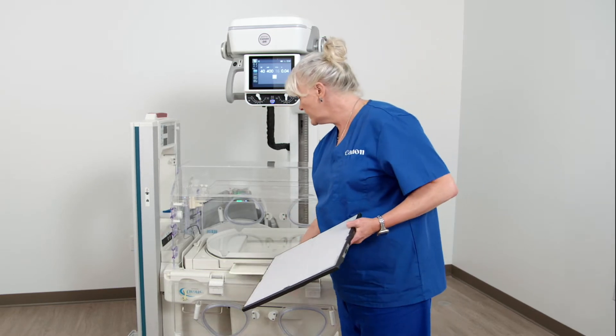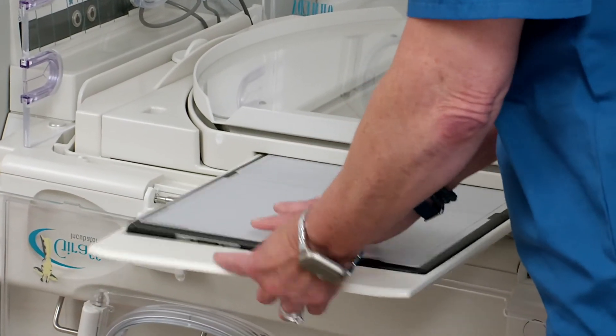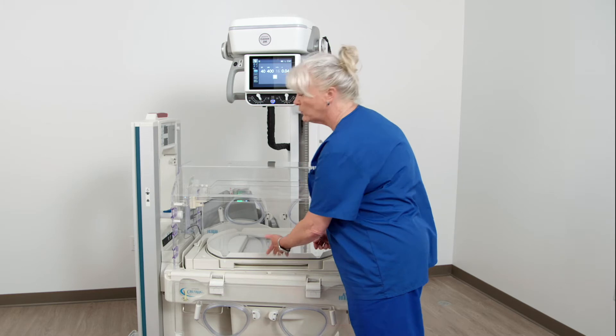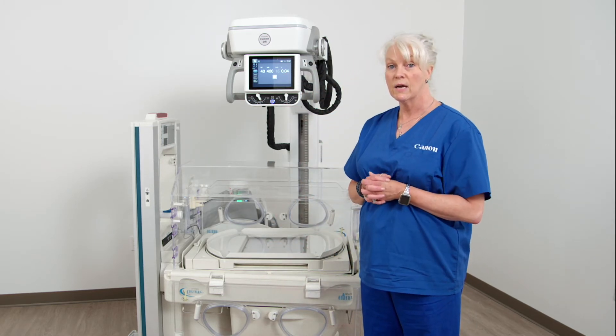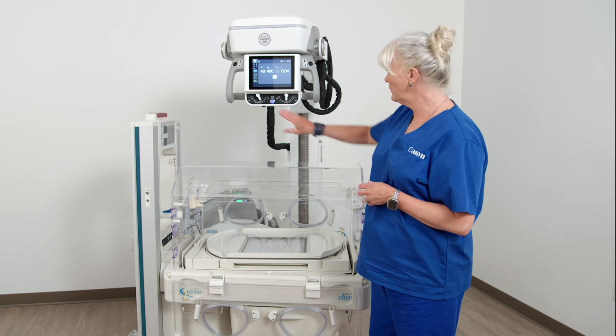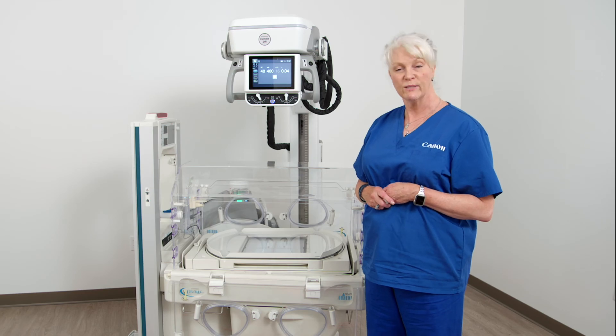You'll see that it fits in here perfectly, slides right into the tray — you don't have to raise the mattress, disturb the baby, less patient contact, or wake a sleeping baby. So you can see that it is the perfect solution for NICU and pediatric procedures.